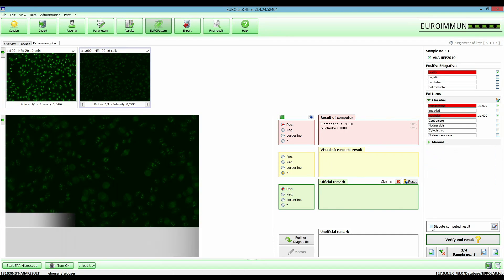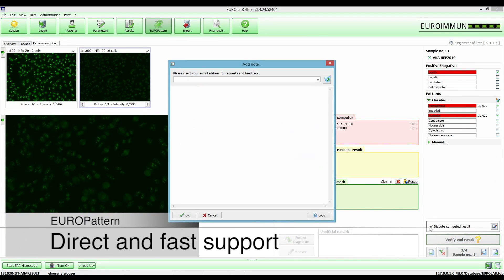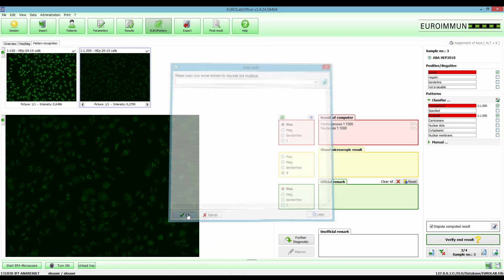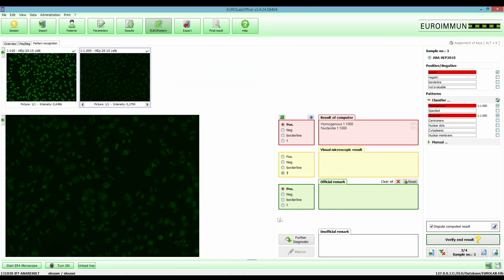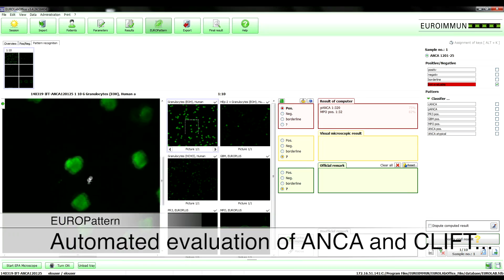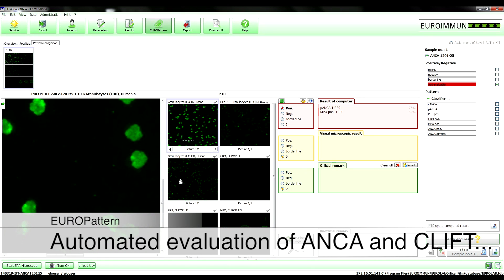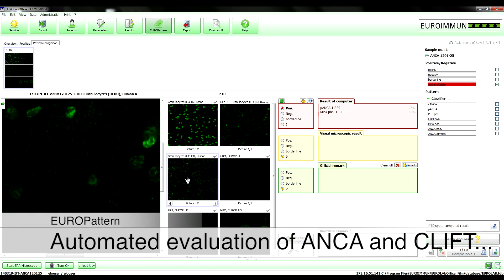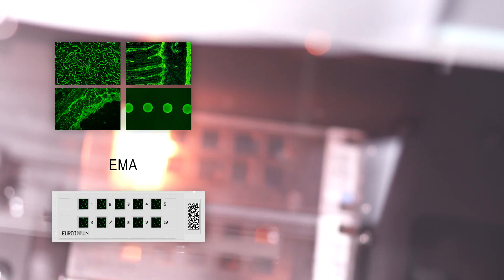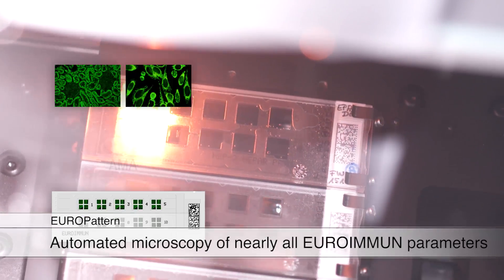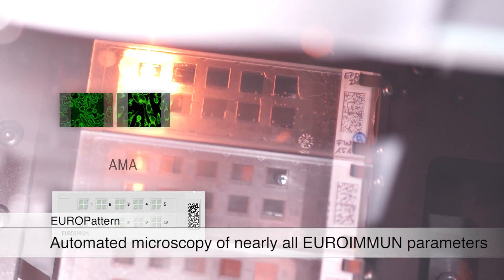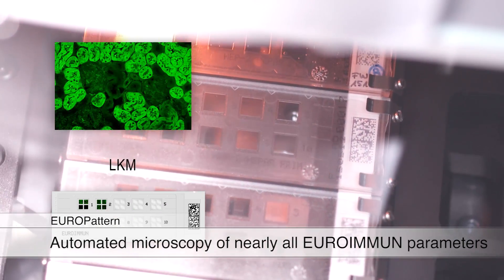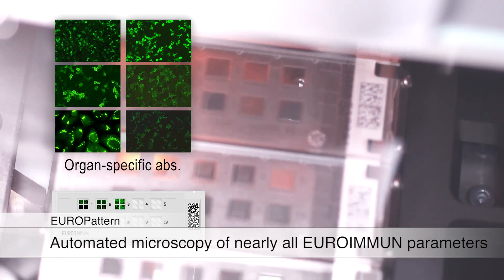In case a technical or diagnostic question comes up, the EUROIMMUN expert support can be requested directly per mouse click from the result overview. Automated evaluation by EUROPATTERN is available not only for ANA and ANCA but also for CLIFT and other analyses. Automated image capturing for subsequent on-screen diagnostics is possible for virtually all further EUROIMMUN parameters.